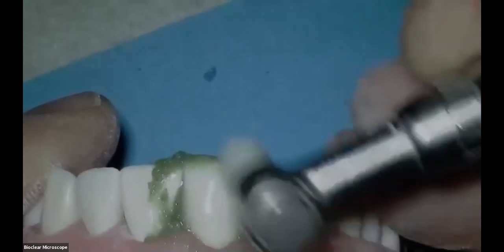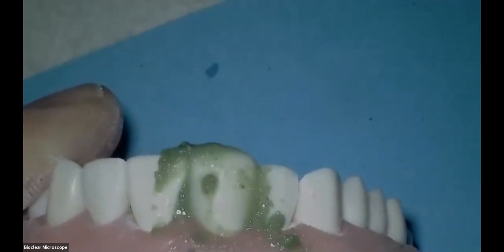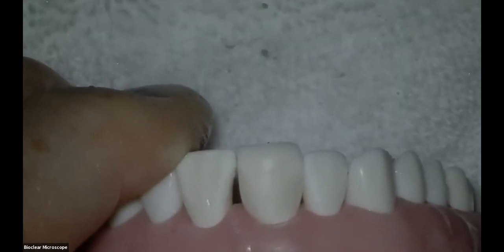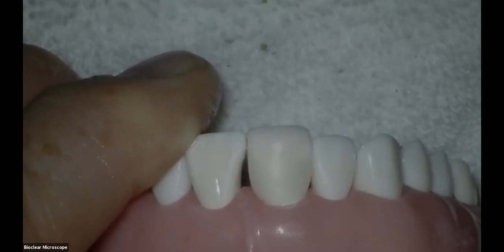Okay, do you have a little dish ready? We're just going to make a mess. Okay, and now we're going to go to the final, which is the Rockstar polishing cup. We got to get all the magic mix off. Okay. All right, and now this is the Rockstar polishing cup. We're going to start with this dry, and then with light pressure and constant movement.